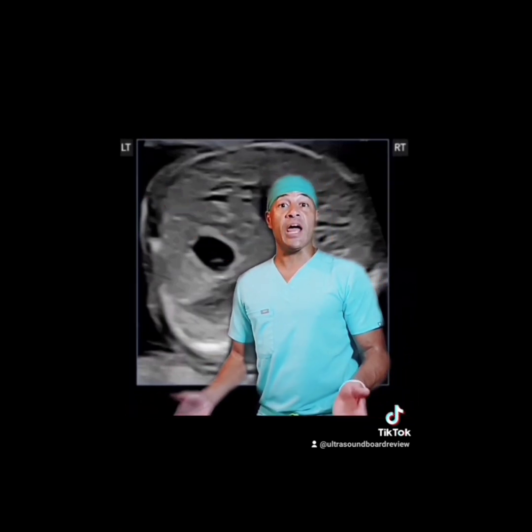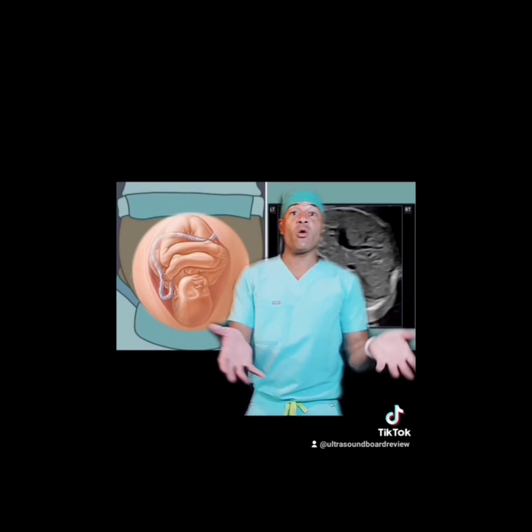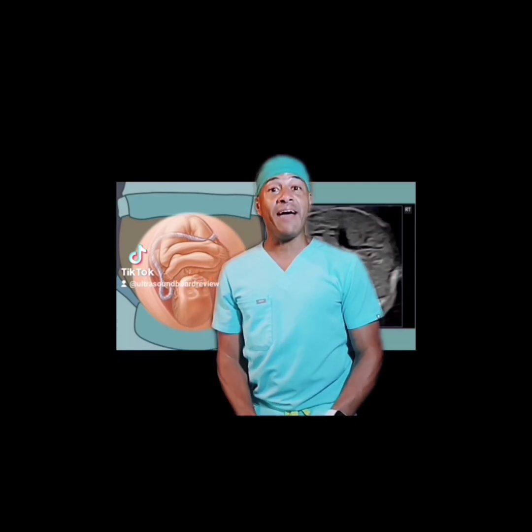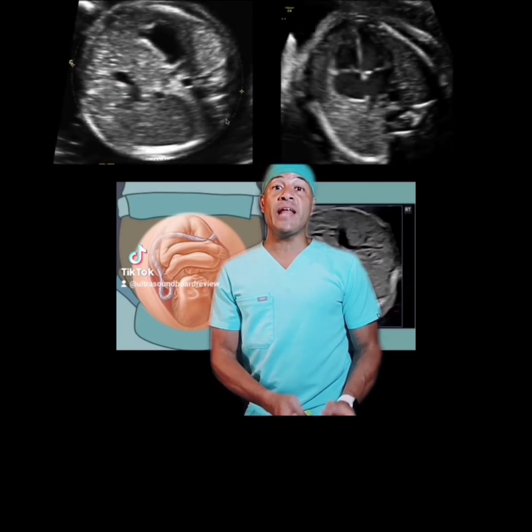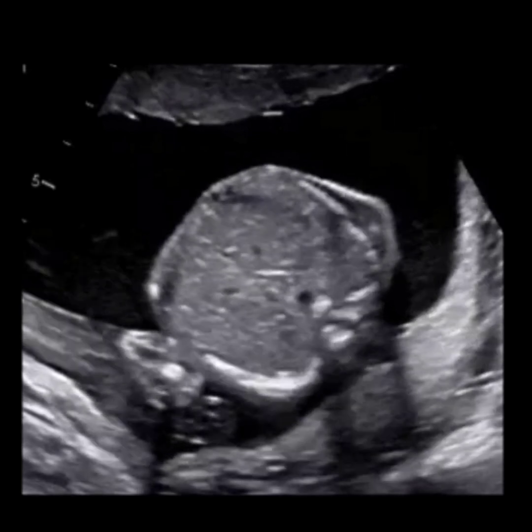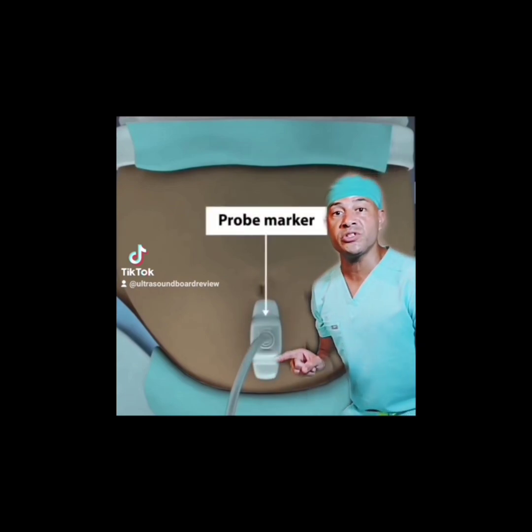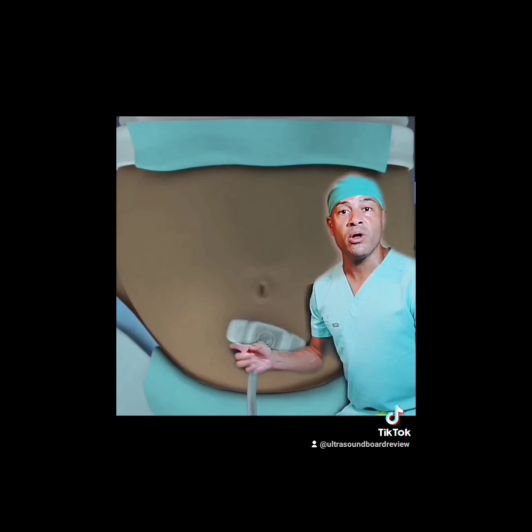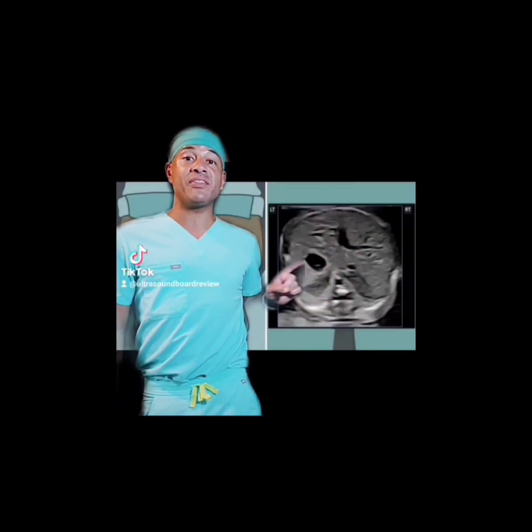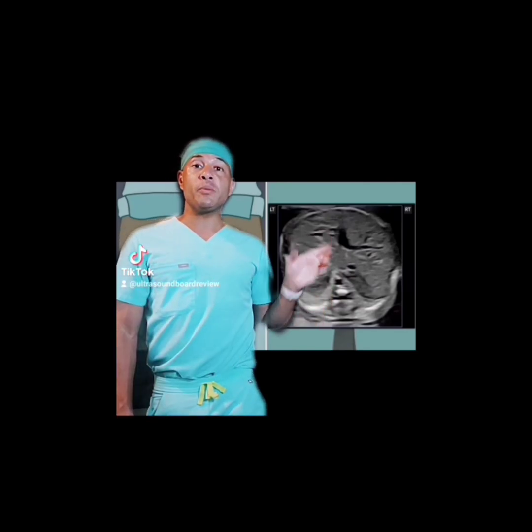The next thing we're going to do is determine fetal situs. These markers don't automatically appear — the machine can't automatically determine the baby's orientation. On your boards, you might be expected to determine fetal situs or fetal presentation without these markers, and in that case they'll give you either two images — one of the heart and one axial view of the fetal abdomen at the stomach level — or a sweeping axial video from the fetal abdomen up to the heart and possibly the three-vessel view. Take your transducer in the transverse view with the body marker on the right side, then sweep caudally for cephalic presentation or cranially for breech.